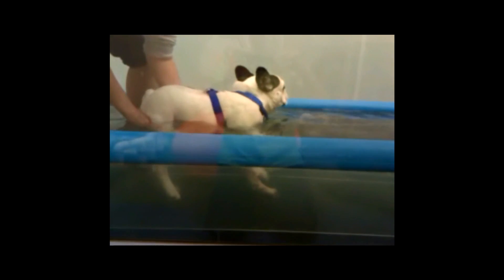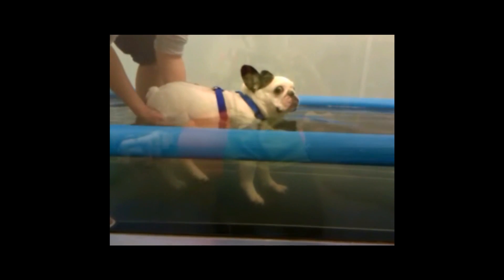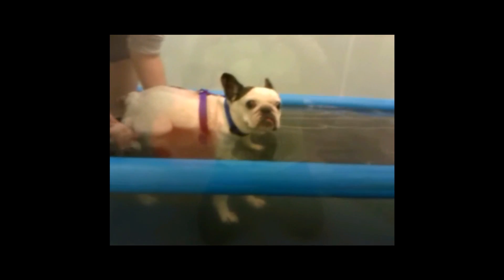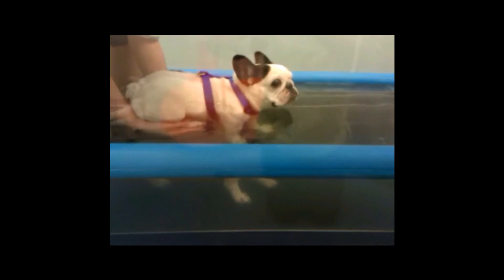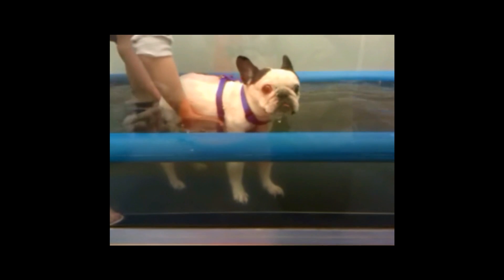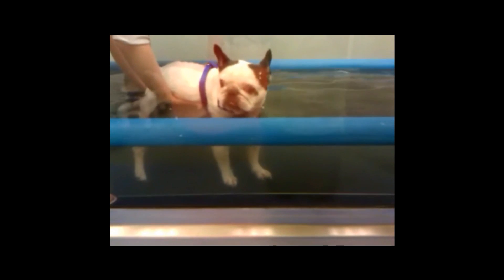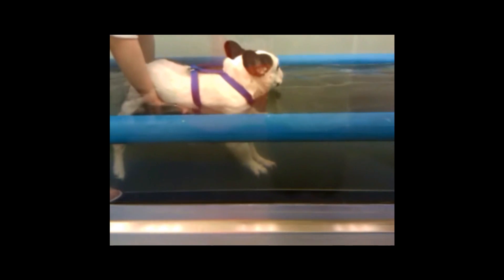This is our first day — this is Zoe. She can't walk very well in the back, and we're just trying to get her to stand a little bit and massage and do range of motion on this leg, so you can do rehab exercise on her and some range of motion in the water. We're waking up some of that sensory motor function she hasn't used in a while. The water helps by allowing her limbs to work with us, extend what works, and activate the muscle.